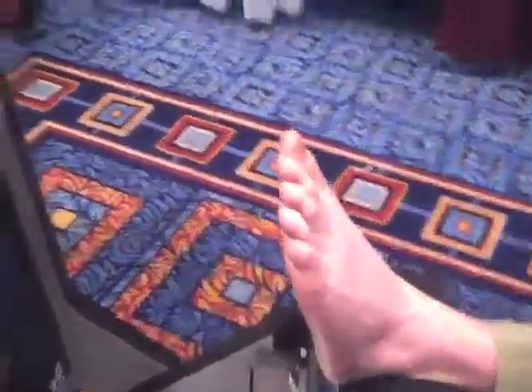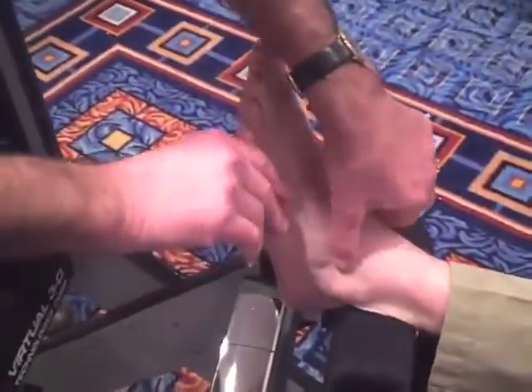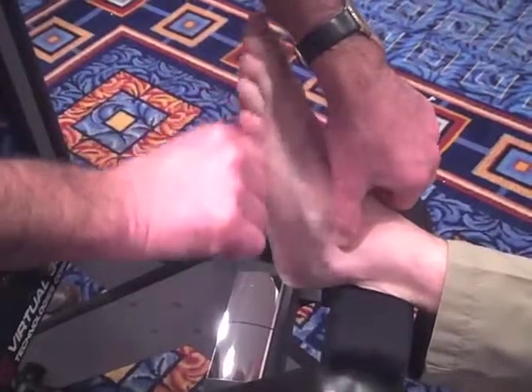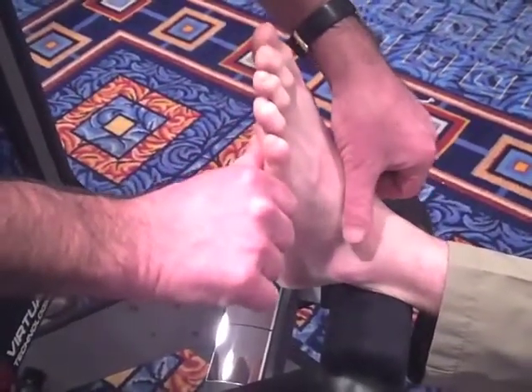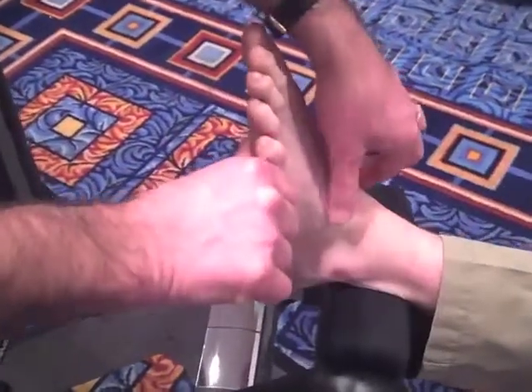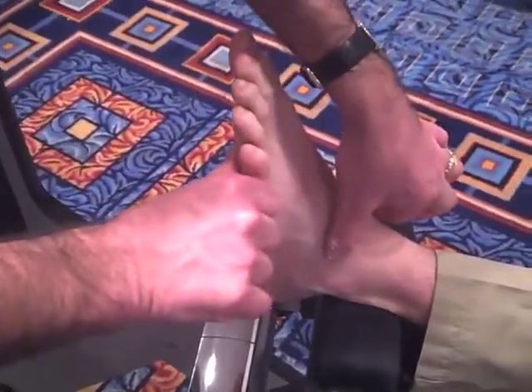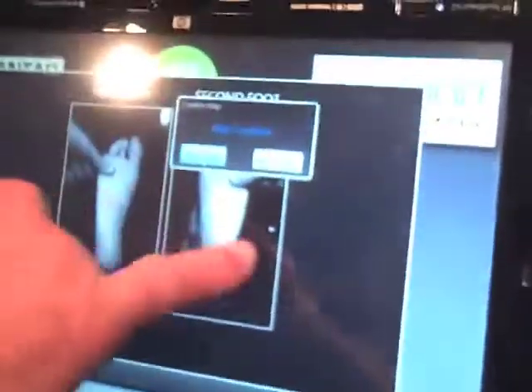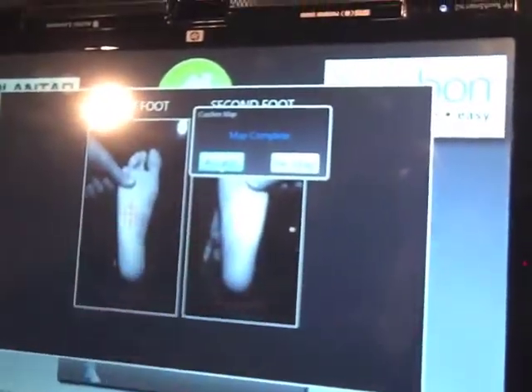We move on to the other foot — same thing. We find neutral subtalar position, relax, find neutral subtalar position, and we load the lateral column. I can leave two hands on the foot, and I can use a foot switch to activate if I want.